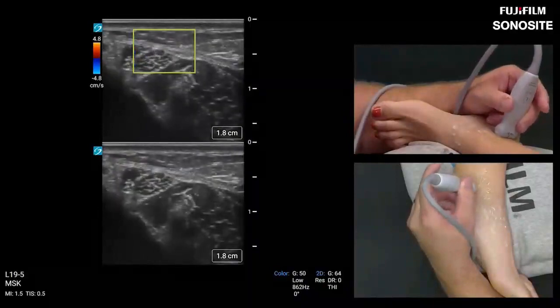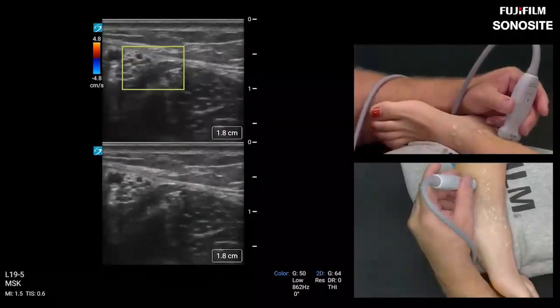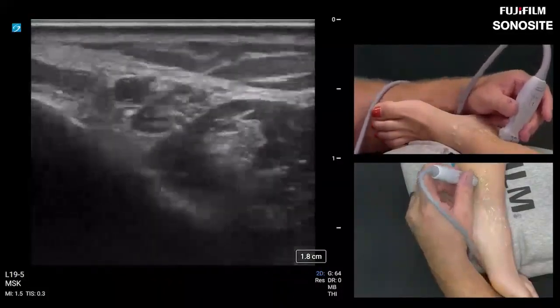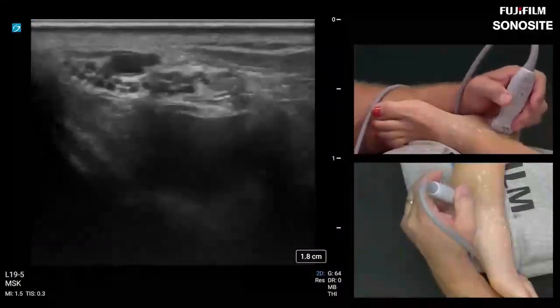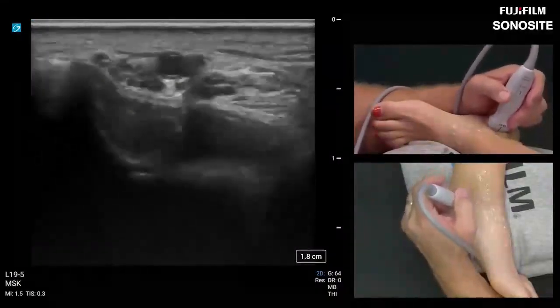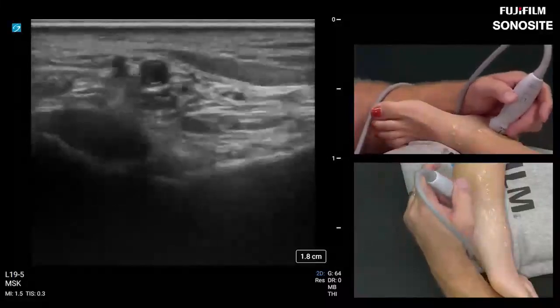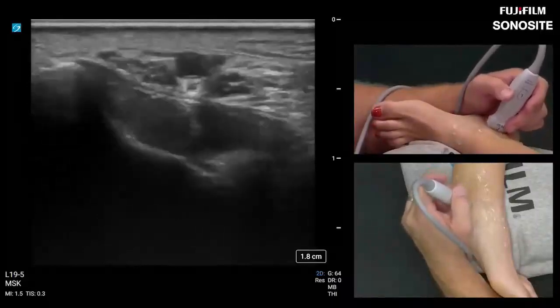We're not going to take any measurements here because there's no standard. There are some articles out there, but there's no real standard out there that everybody follows, like the carpal tunnel. It's just good to look at the nerves, see what might be occluding them, any space occupying masses, any nerve diameter changes, all those things that we look for in the other nerve entrapment pathologies.